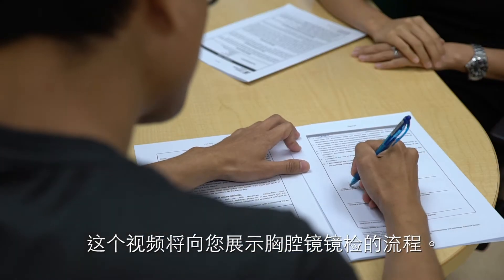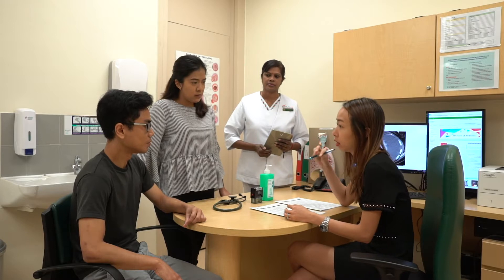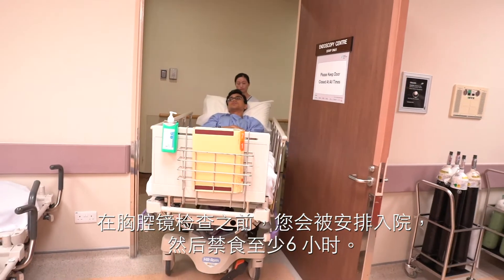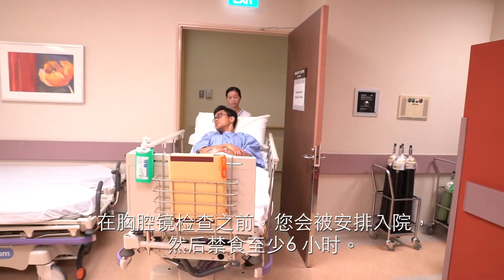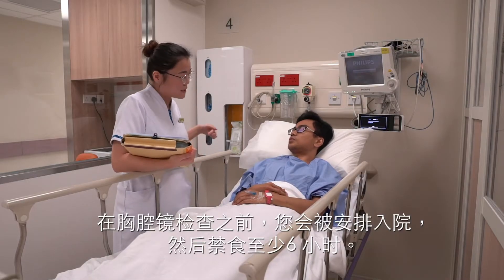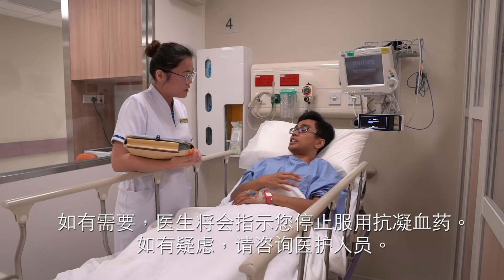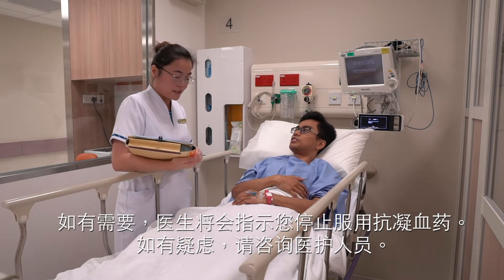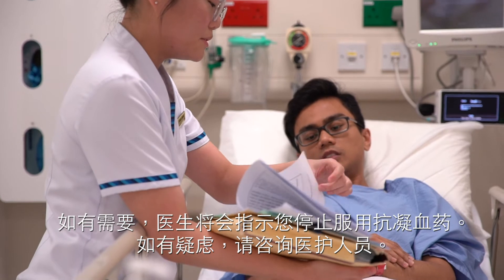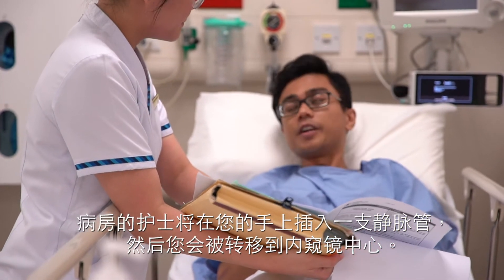In this video we will show you what to expect when a thoracoscopy is performed. You may be admitted prior to the procedure and will be brought from the ward to the scope center. You will be asked to fast before the procedure, and some regular medications such as blood thinners may need to be stopped. Please clarify if unsure.